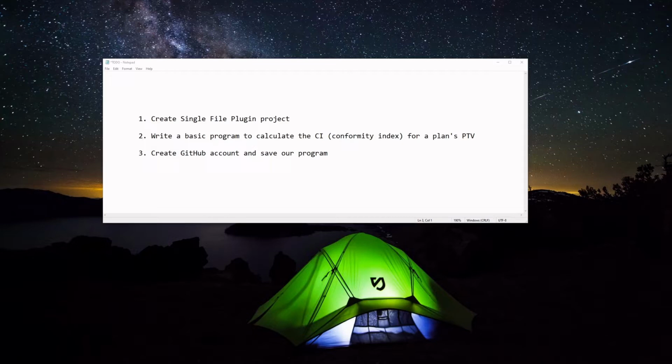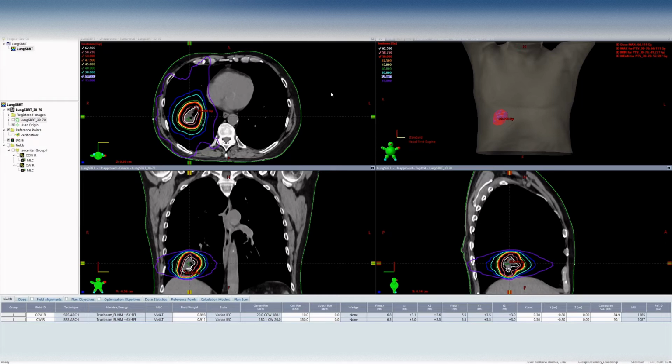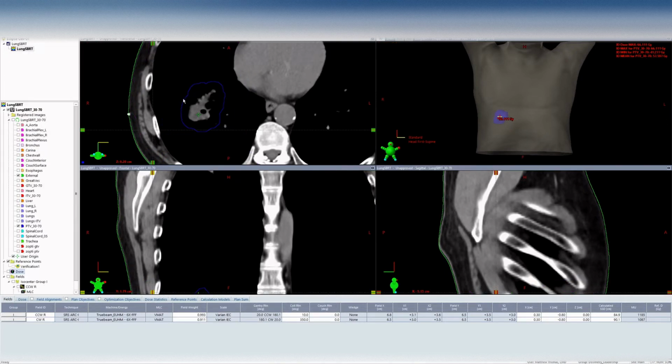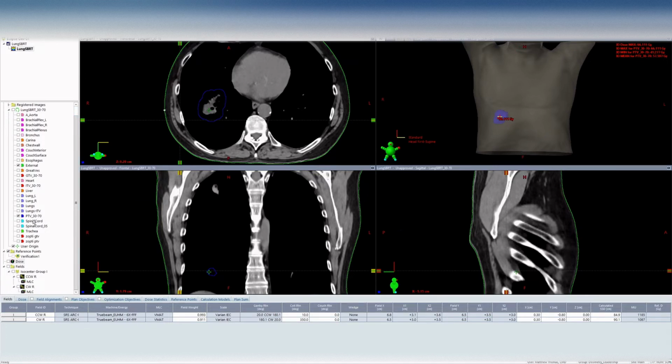Okay, so I had paused the video and I went ahead and put together a sample SBRT plan to provide a little bit of context for what we're trying to do. This is for people that maybe aren't as familiar with treatment planning or that sort of thing. So this blue object right here is called a structure. We call this the target. And there's been a certain number of dose or radiation that's been prescribed to it. And so we've created this treatment plan, and this is just a test patient, so this isn't like a real setting or anything like that.